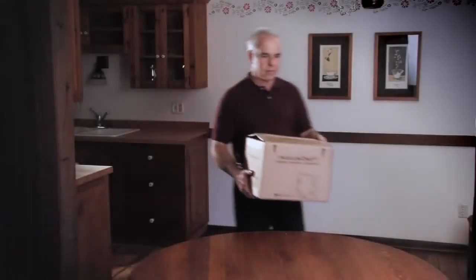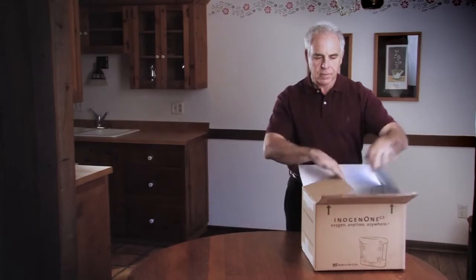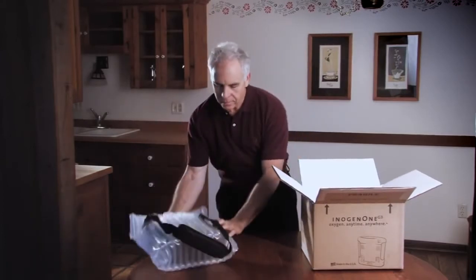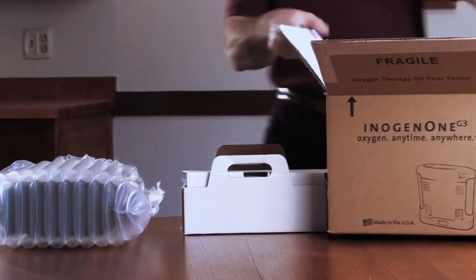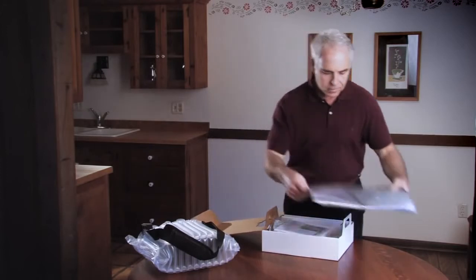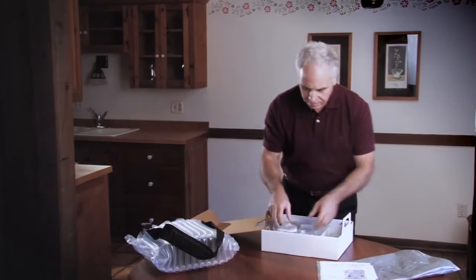When setting it up for the first time, you will want to set the system up on a table near an electrical outlet. If you have not yet unpacked your boxes, you may want to pause this video and do so now. Be careful not to throw anything away yet. Please read the enclosed Getting Started guide and user manual in their entirety before using the Inogen One G3.